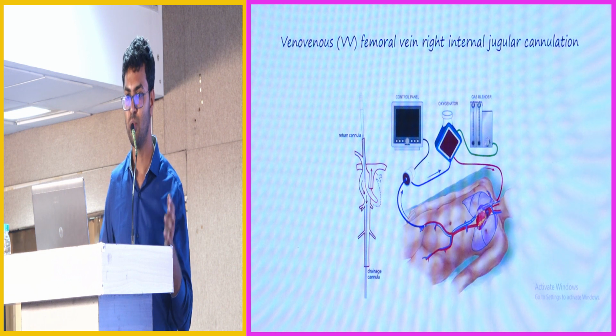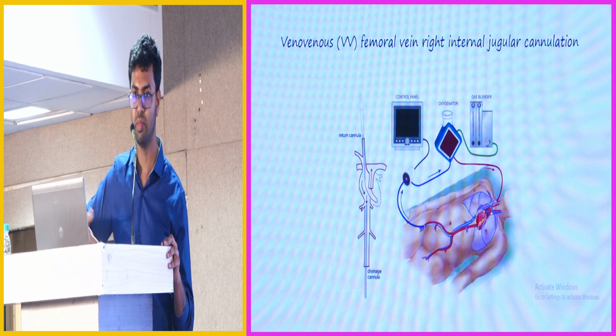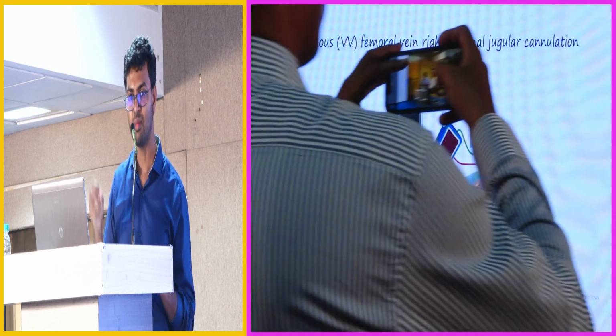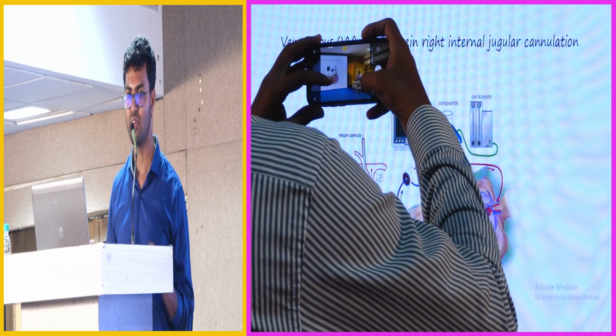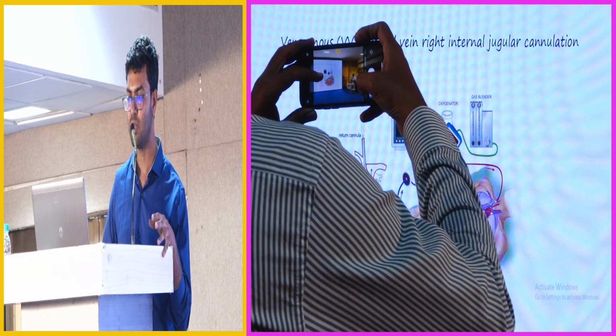We usually use a centrifugal pump, but in your hemodialysis case you have roller pumps. If you use a roller pump in this case, which has to pump 3 to 4 liters, maybe up to 6 liters per minute of blood, the pipes will crack within 8 hours, and plastic microparticles will be released into the circulation, and you will have a rupture of the ECMO circuit and your patient will bleed to death. So usually we use a centrifugal pump.